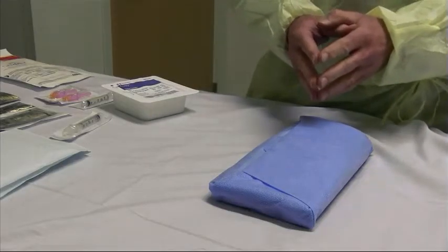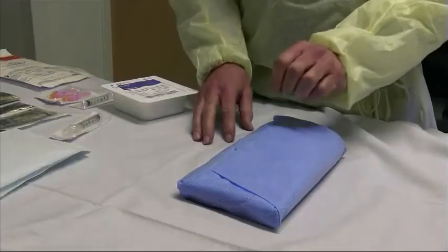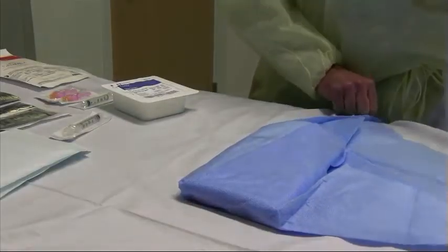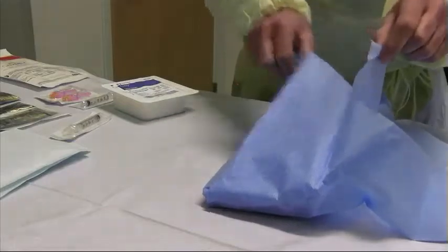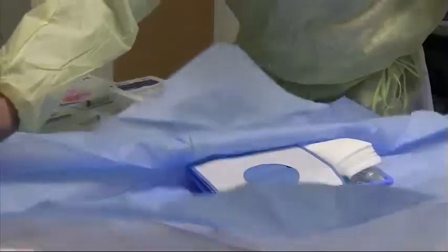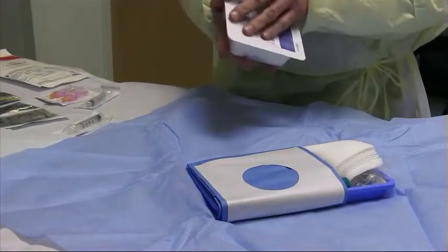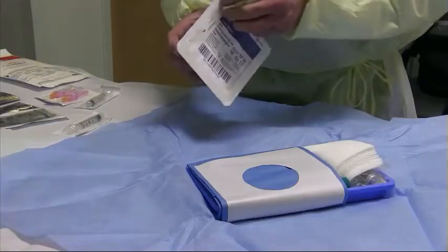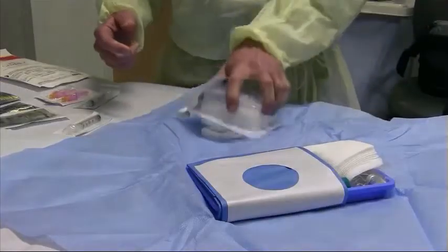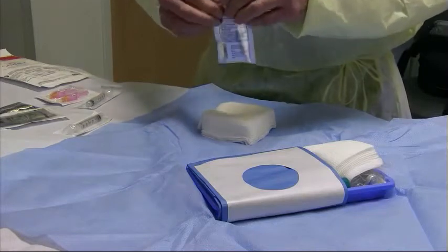The first thing you need to know is how to set up the tray. The trays come pre-packaged like this in our department. Upon opening, you don't need to be sterile at this point, but you need to carefully open them — pull these little tabs — being careful not to contaminate what's inside. They will open in a sequential fashion revealing the tray and all the contents we need. Once the tray is open, we can add our ancillary items. We start with some four by fours, opening them carefully not to touch what's inside, and carefully dump onto the tray.